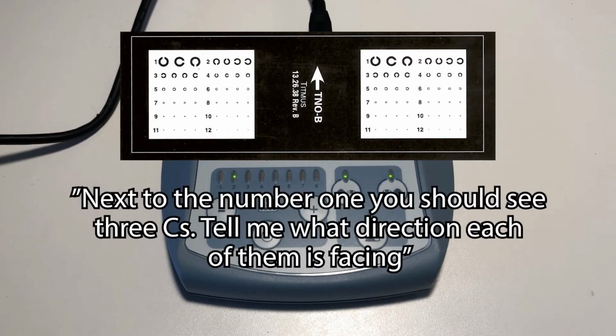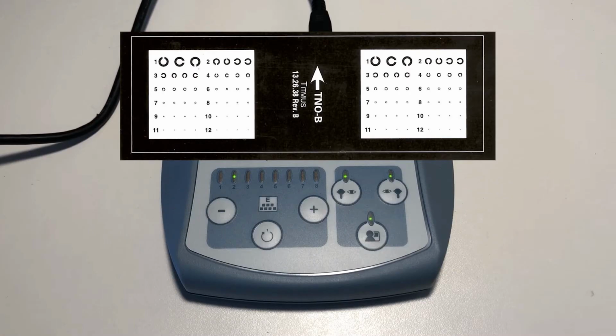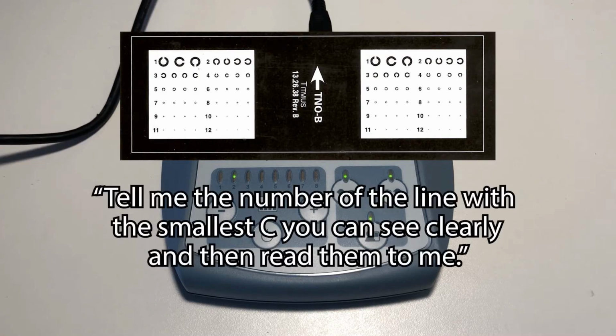Say to the patient, next to the number 1 you should see 3 C's. Tell me what direction each of them is facing. Ensure the patient reads them as expected by comparing their answers to the reference on the record form. When they have done this, say, tell me the number of the line with the smallest set of C's you can clearly read, and then read them to me.